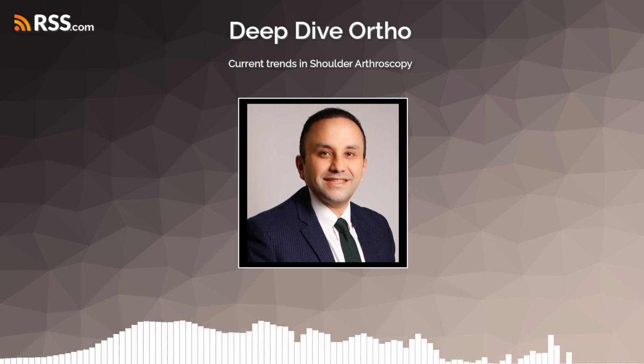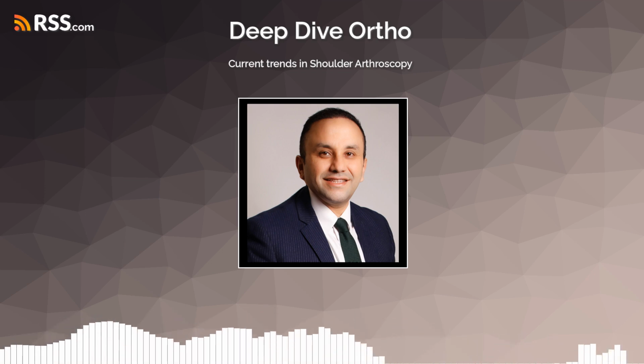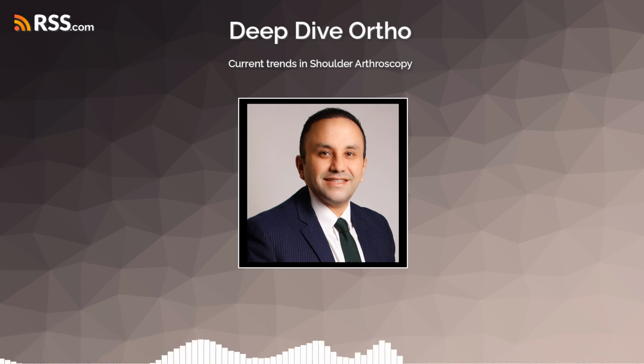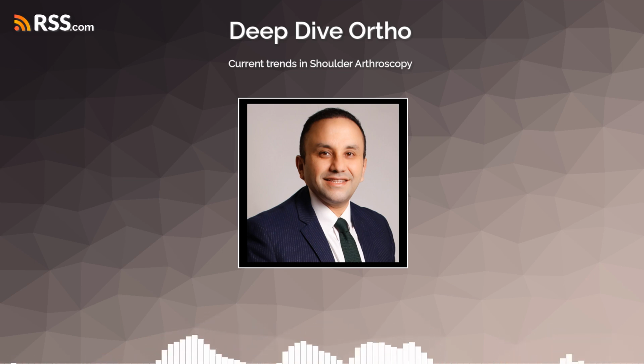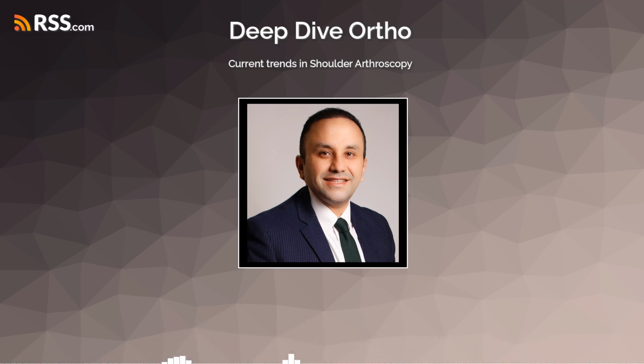Right. Let's move on to some specific shoulder conditions and their surgical management. The Latarjet procedure is a well-known option for people with shoulder instability and significant bone loss. Can that be done arthroscopically? Yes, it can. The traditional Latarjet procedure involves taking a piece of bone called the coracoid process from the front of the shoulder blade and transferring it to the front of the glenoid to act as a bony block. Right, the bone block. That's been performed as an open surgery for a long time and has a good track record for stabilizing the shoulder.